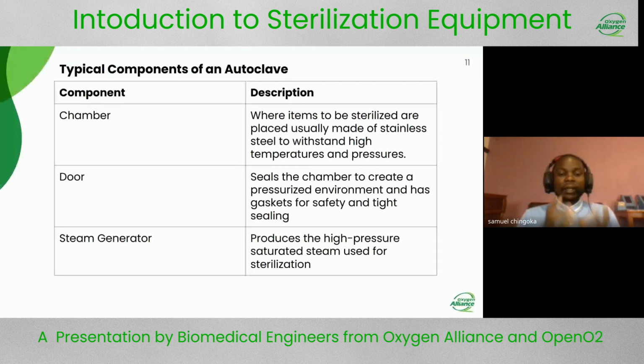which completely put a separate environment where our objects to be sterilized will be. So these seals make a tight sealing so that we separate our environment to the special environment where we want to sterilize our equipment, our objects.